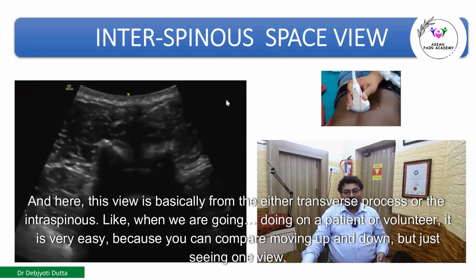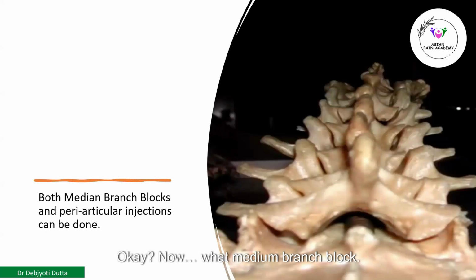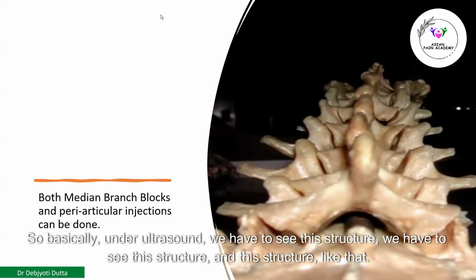And this view is basically from either the transverse process or the interspinous ligament. When we are doing it on a patient or volunteer, it is very easy because you can compare by moving up and down, but just seeing one view, it is a little bit difficult to differentiate whether we are over the spine or not. Now, both medial branch block and the periarticular or intra-articular injection can be done with ultrasound. But remember, ultrasound can only show this picture. So basically, under ultrasound, we have to see this structure, this structure and this structure like that.